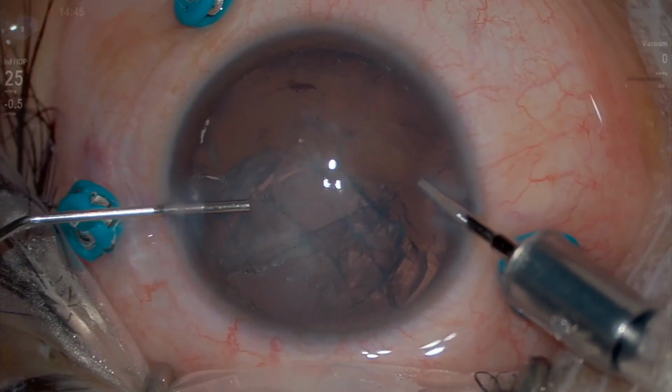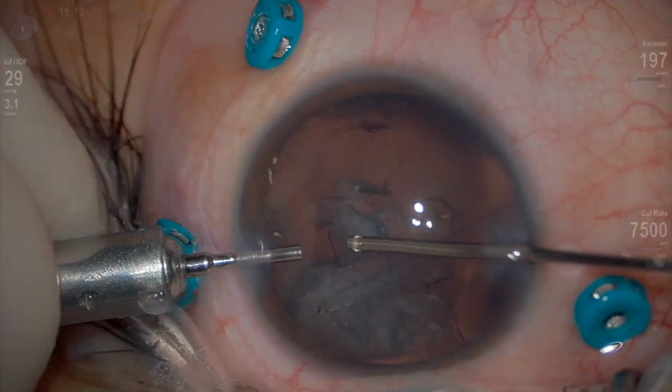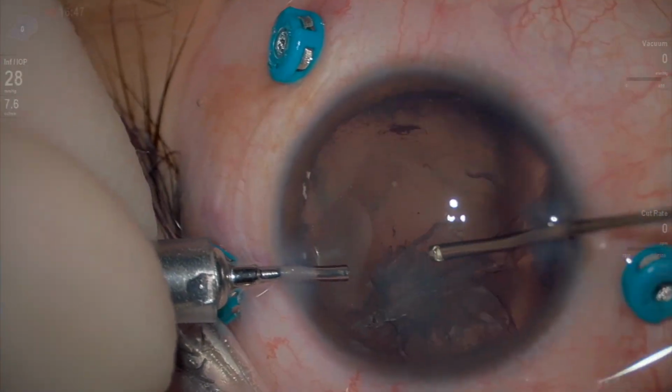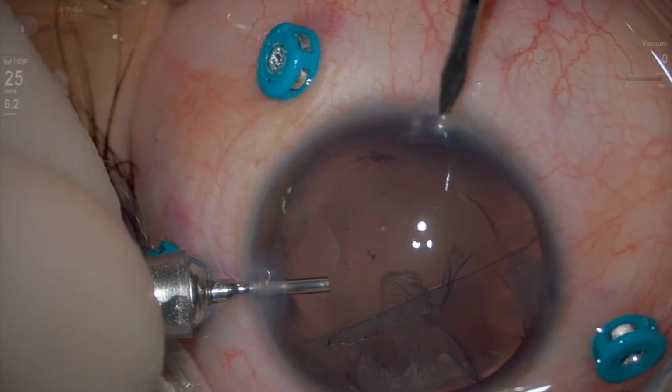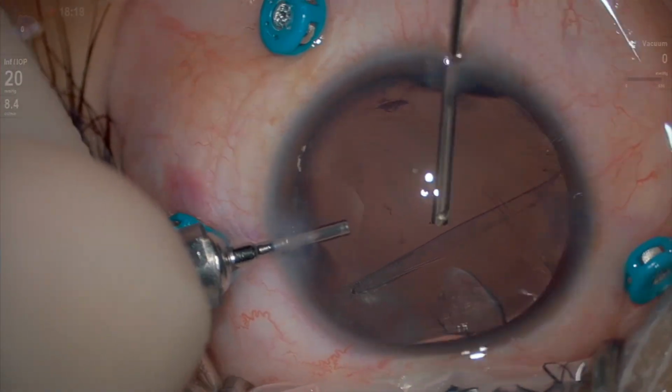Now viscoelastic is placed in the anterior chamber and the instruments are placed to the other side. In a case like this, it's very important to remove all the lens matter so as not to have significant postoperative inflammation. To achieve this, another paracentesis is made to have more ergonomic access to the lens matter.